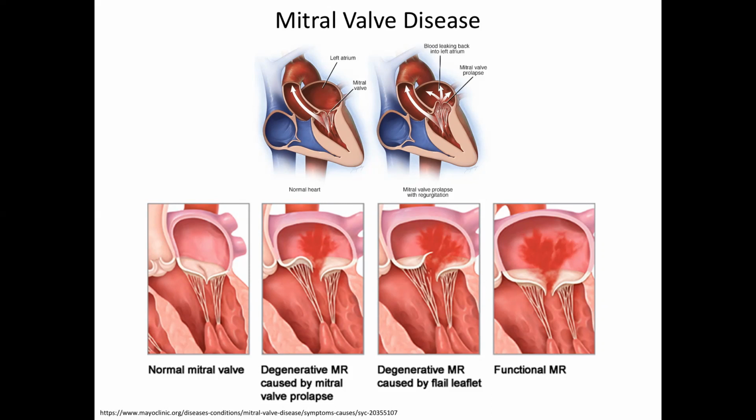So if you have a transesophageal echo probe and you see where your device is, you can get an idea of which direction it's pointing, and the mechanics of it getting stuck in the divot can be observed directly, say on fluoroscopy, while you're doing the TEE. You can also place an echo probe on a catheter. So this is like a TEE probe shrunken down to the size of a catheter.